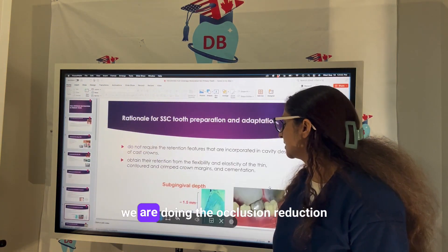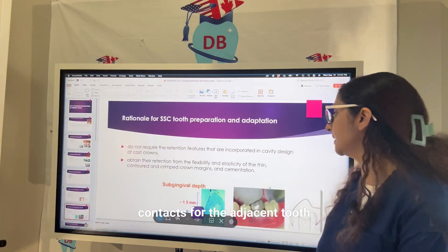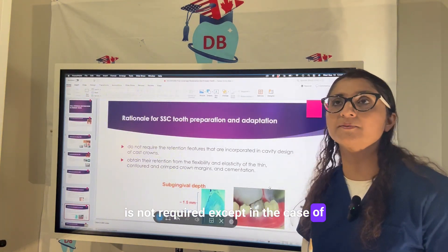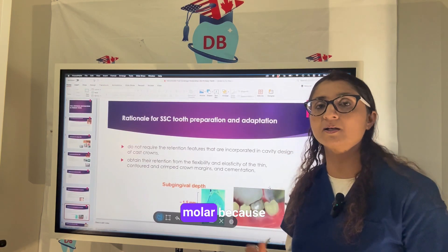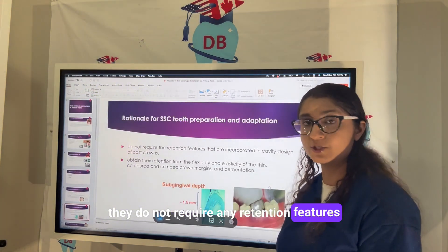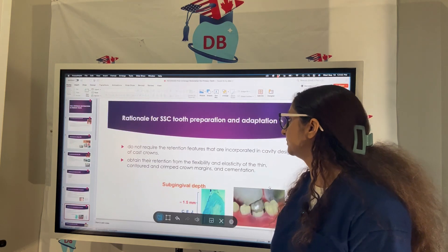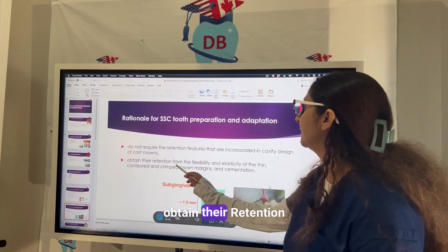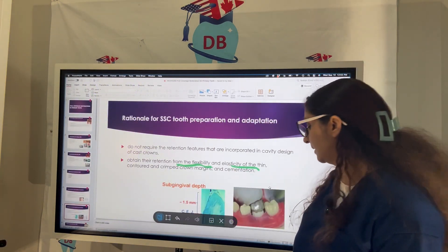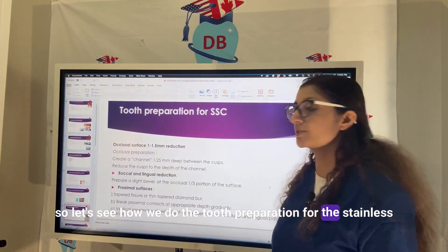We perform occlusal reduction, proximal reduction to break contacts with adjacent teeth, and buccal and lingual reduction is not required — except at the mesial of the mandibular first molar where the cervical bulge is very prominent. These crowns do not require any retention features incorporated in cavity design, as stainless steel crowns obtain retention from the flexibility and elasticity of their thin contour and crimping around the crown margins along with cementation.